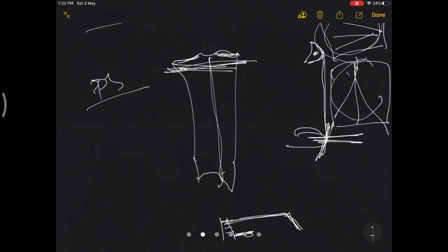So if you are planning to take a 7 or 8 mm cut, and there is around 1 to 2 mm of cartilage worn on the medial side, and you measure from the medial aspect, then you will almost be cutting around 10 mm. So it is advised that if you are measuring on the medial side, you take a 2 mm less cut.